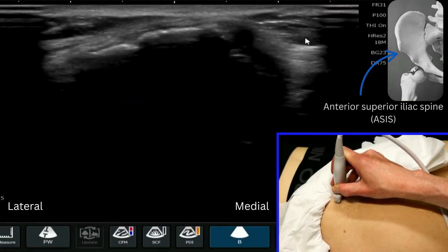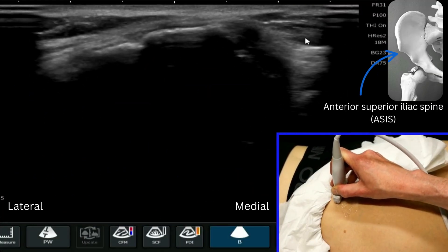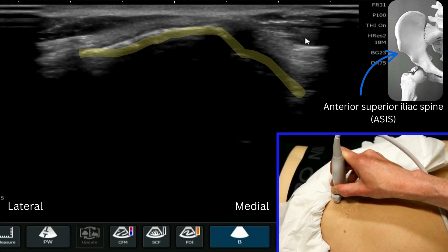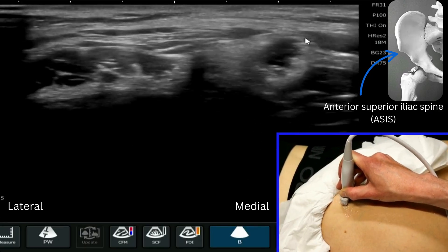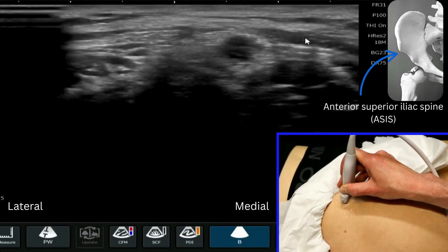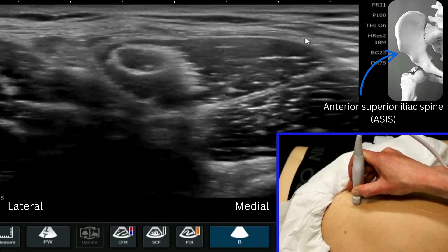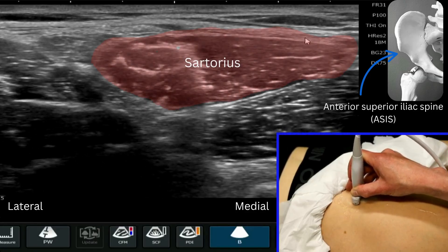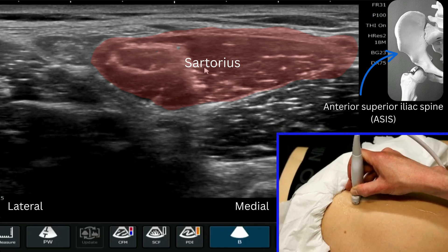My probe is now placed on the anterior superior iliac spine. When we go distal with the probe in the transverse plane, we can see some muscle fibers coming off it, both medial and lateral. If we follow the medial one, you can see this triangular shape, which is the sartorius muscle — a sort of triangle shape.